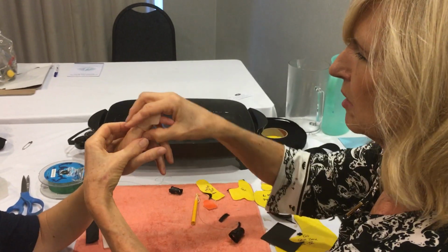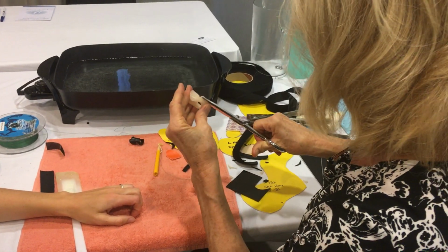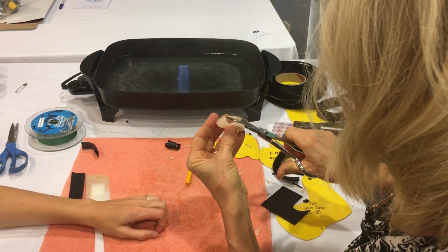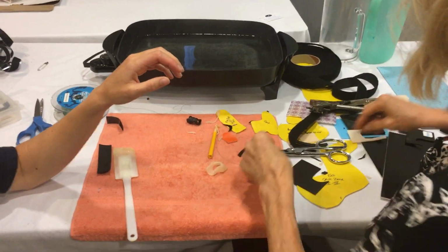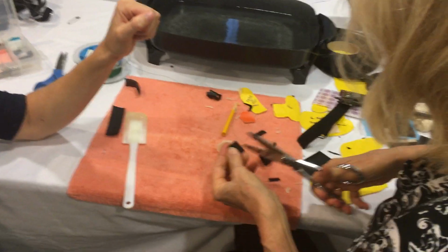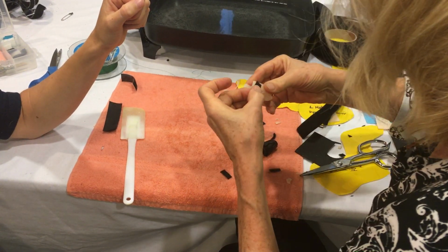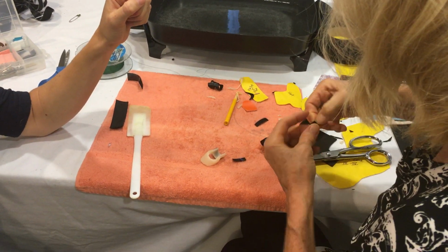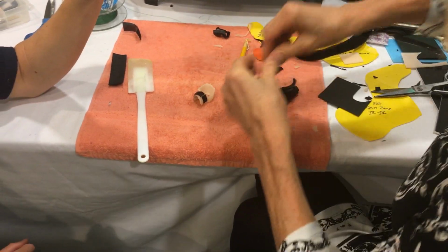So then we're going to take this off. I'm going to remove this. Trim it. Trim the dorsal piece as well. Okay, so then I would put my Velcro on there. And again, I would use the finger Velcro here. So I just basically put a Velcro all the way around the back there. This piece will work for now.